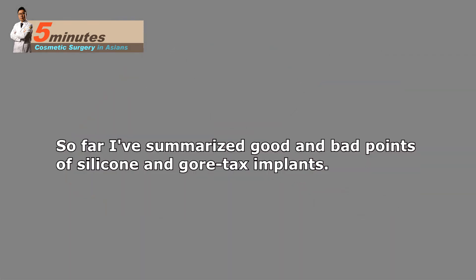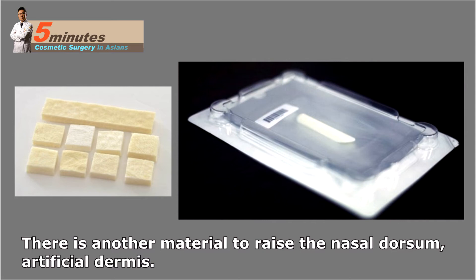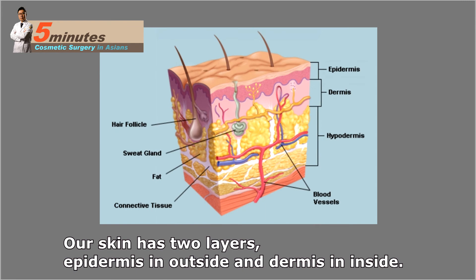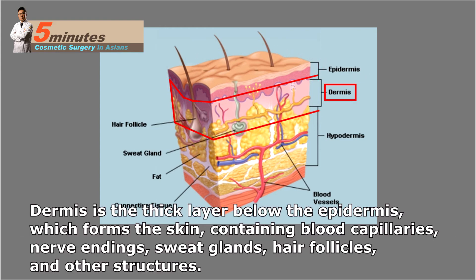So far I've summarized the good and bad points of silicone and Gore-Tex implants. From now on I'd like to introduce other materials. There is another material to raise the nasal dorsum: artificial dermis. Our skin has two layers — epidermis on the outside and dermis on the inside. The epidermis is a thin barrier to protect from the environment and regulate water release from the body. The dermis is a thick layer below the epidermis containing blood capillaries, nerve endings, sweat glands, hair follicles, and other structures.